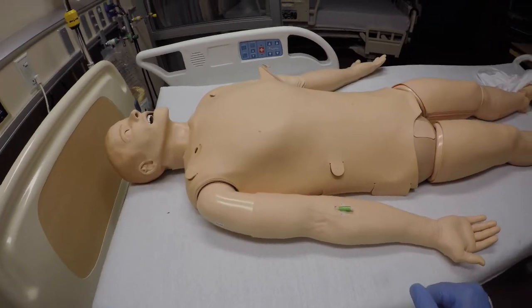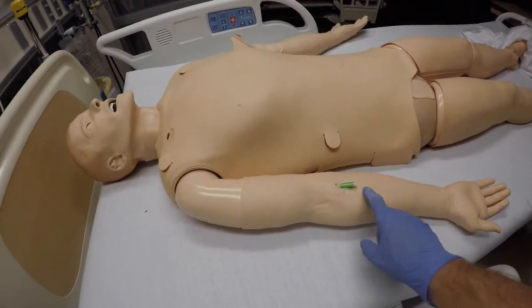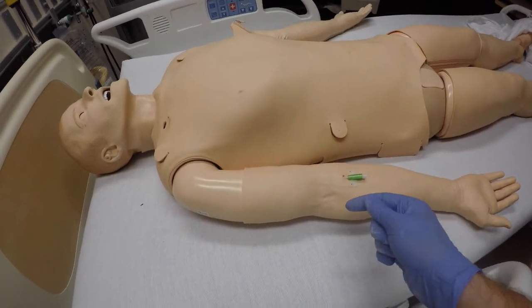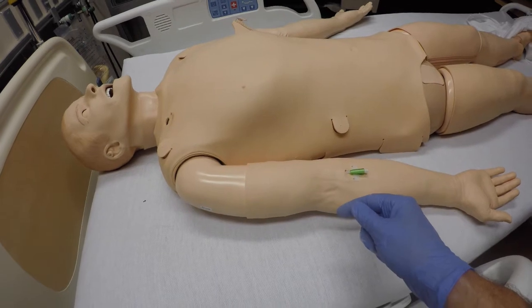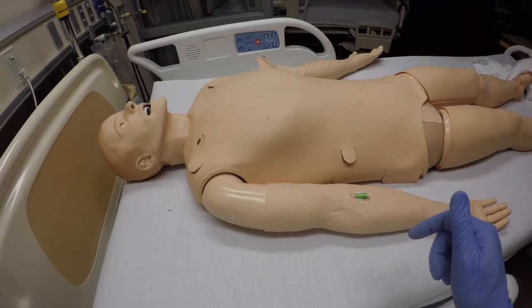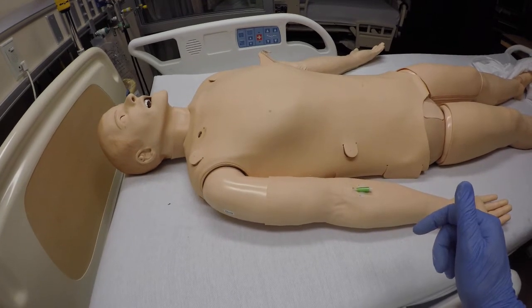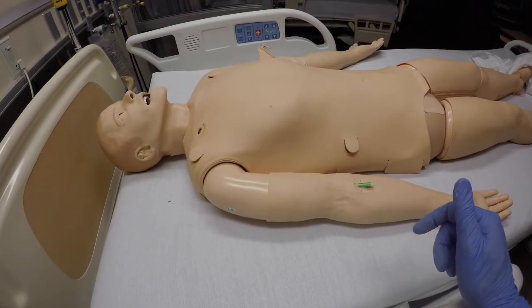Before we start, the intention in this video is to customize the right IV arm when you don't have flow or are having major resistance of IV fluid flow through the right IV arm for SimMan 3G. This customization is considered a post-warranty repair. Always consult with your manufacturer if you're doing customization of your mannequin.